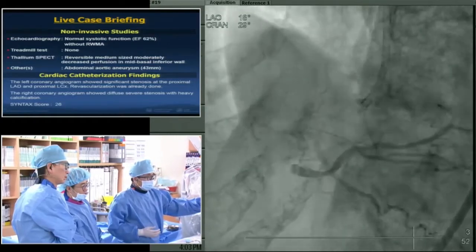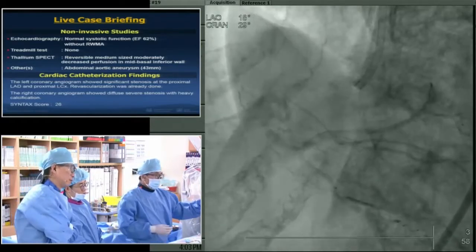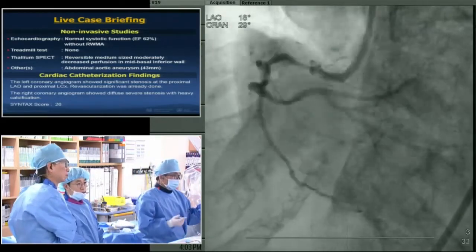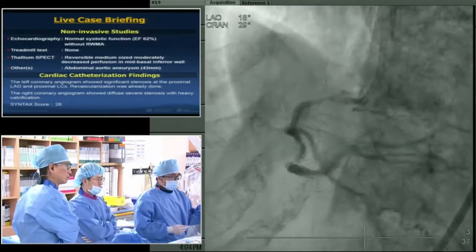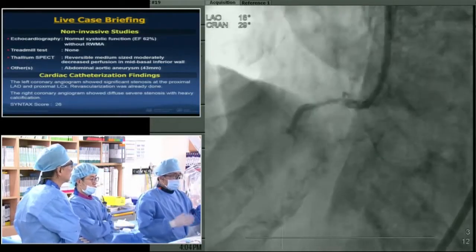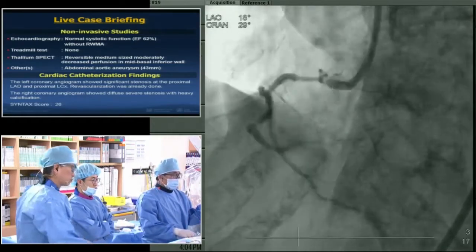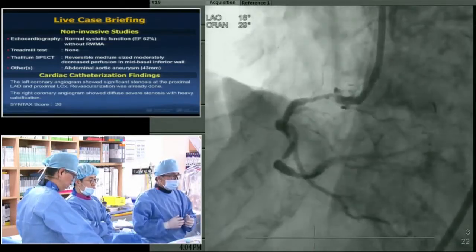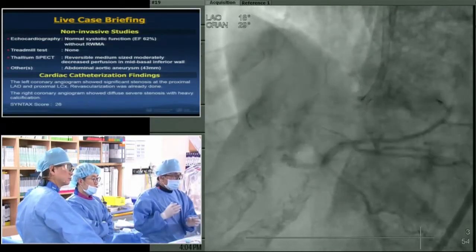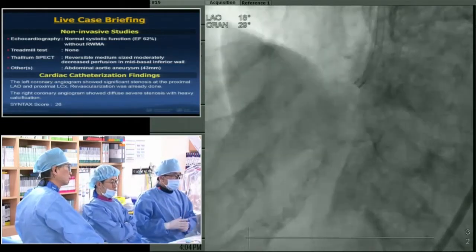We had discussed using the JR and a straightforward strategy for this patient, because in our experience, if we introduce the wire, the accordion phenomenon usually occurs and the flow is compromised. So that was anticipated. In this kind of case, the approach is to go straight forward, put the stent rapidly, and do the stent optimization later.